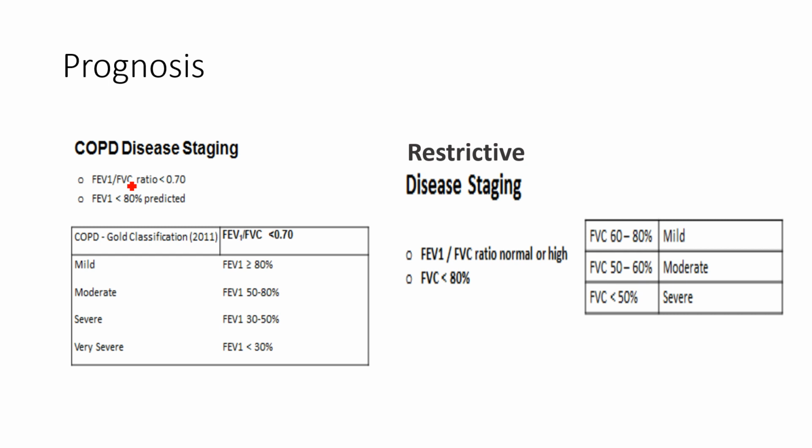So we're very rarely going to be testing this in a normal, healthy patient. So if we look at FEV1 FVC ratio, we're probably not expecting it to be normal. FEV1 FVC ratio will let us know obstructive or restrictive, because we know obstructive will be less than 0.7, and restrictive will be normal or high. Again, these aren't going to be healthy patients we're typically assessing this in.